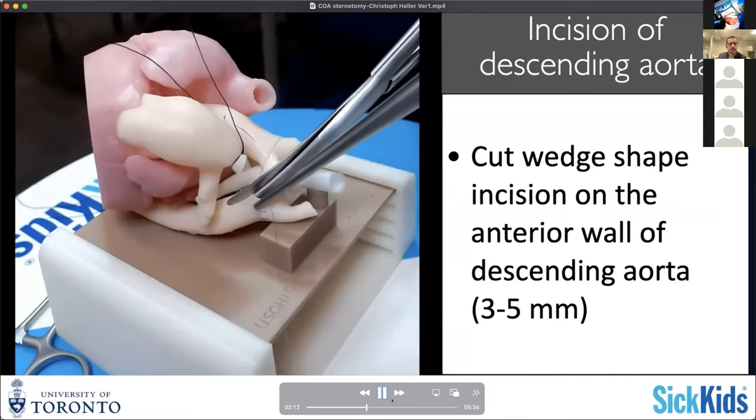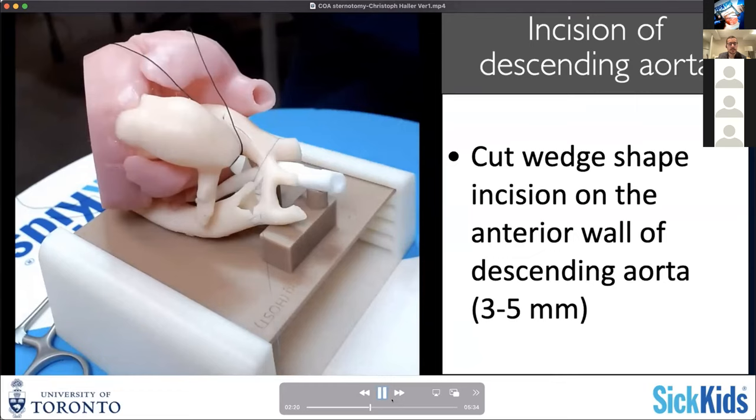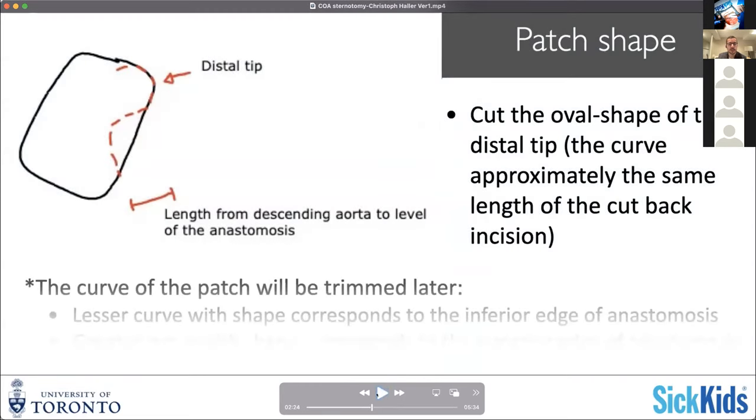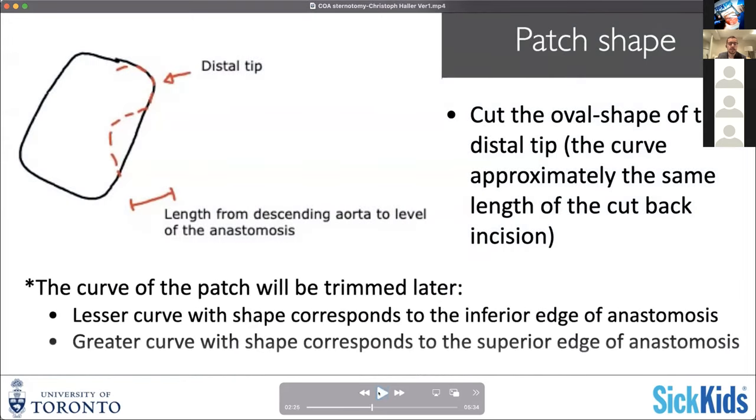Your incision basically allows two things at once: one is to cut through any residual ductal tissue, but also to allow the patch augmentation beyond the actual level of the posterior wall anastomosis. Most of the time I would use autologous pericardium treated with glutaraldehyde to augment the aortic arch. If you have a more or less rectangular shape of your pericardium, I start with a bit of a rounded tip and basically just shape that very proximal segment. Then usually you want to have a little bit of an angle to accommodate the curvature of the aortic arch.